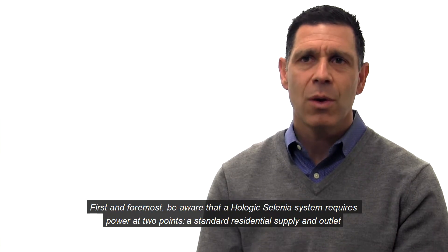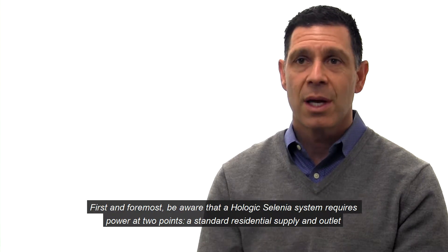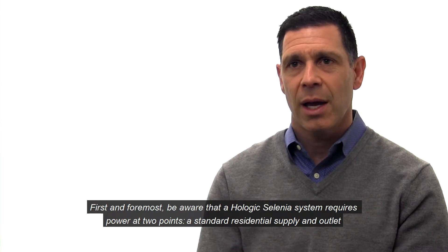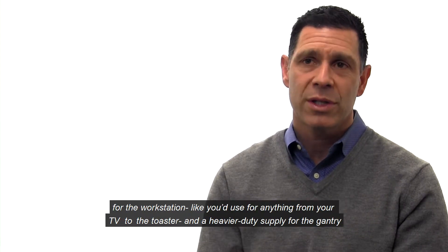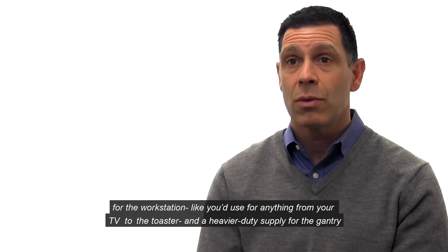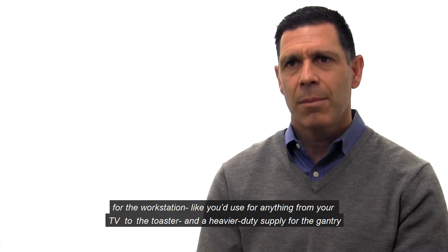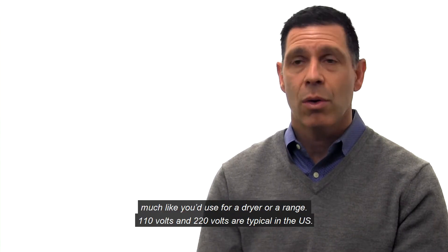First and foremost, be aware that a Hologic Selenia system requires power at two points: a standard residential supply and an outlet for the workstation — like you'd use for anything from your TV to the toaster — and a heavier duty supply for the gantry, much like you would use for a dryer or a range.